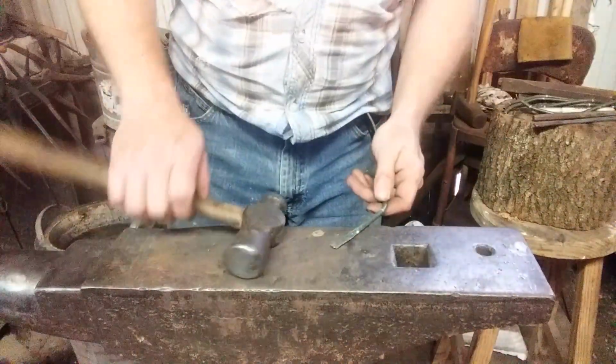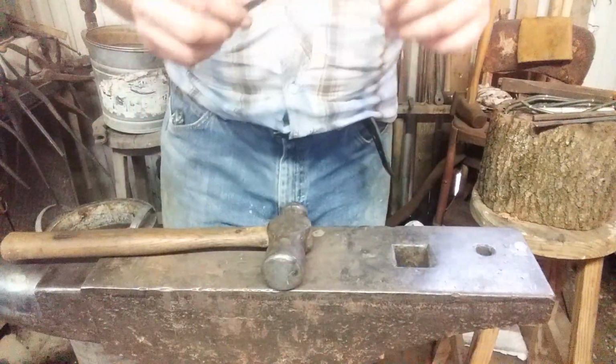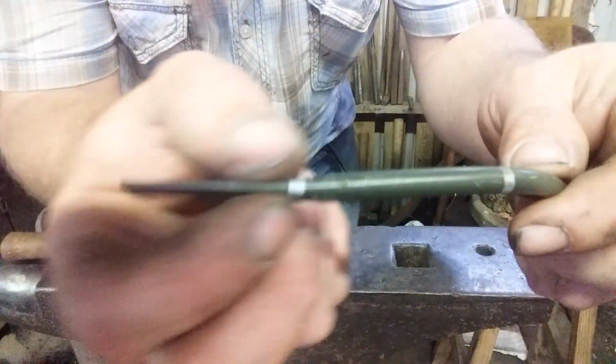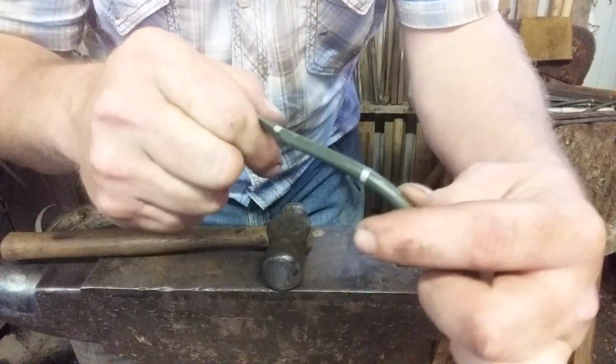Wouldn't be a forging channel if there wasn't some hammering going on. The hammer fixes a lot of things. Anyway, I'm going to give you kind of a close view. You notice I didn't pinch it in as a hard edge there. I let it kind of flare out. That way it's less apt to bend.